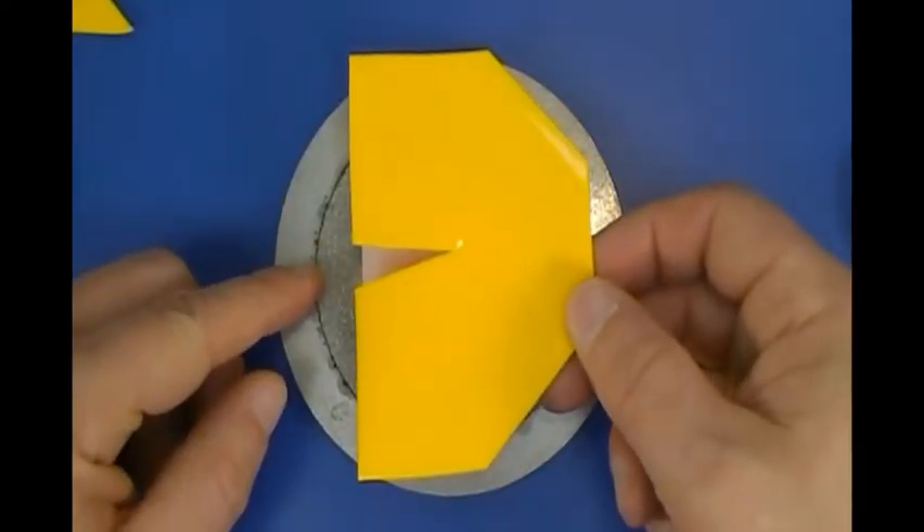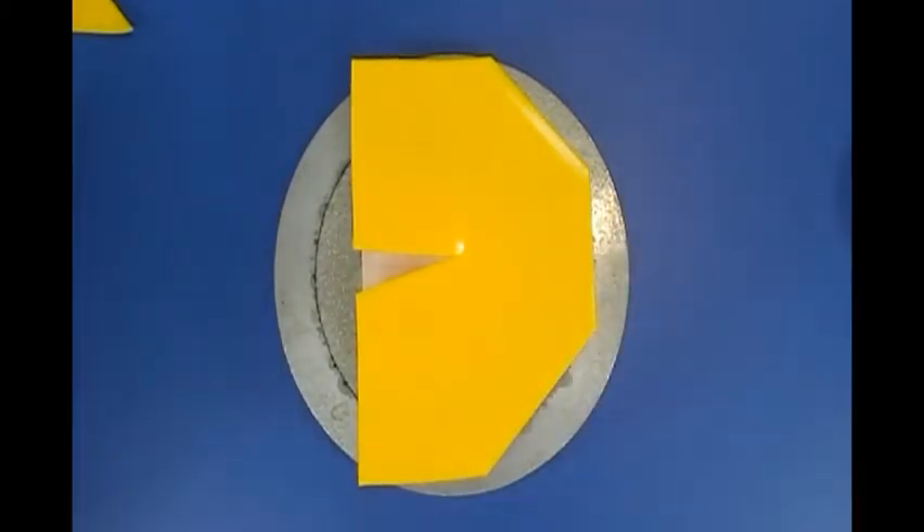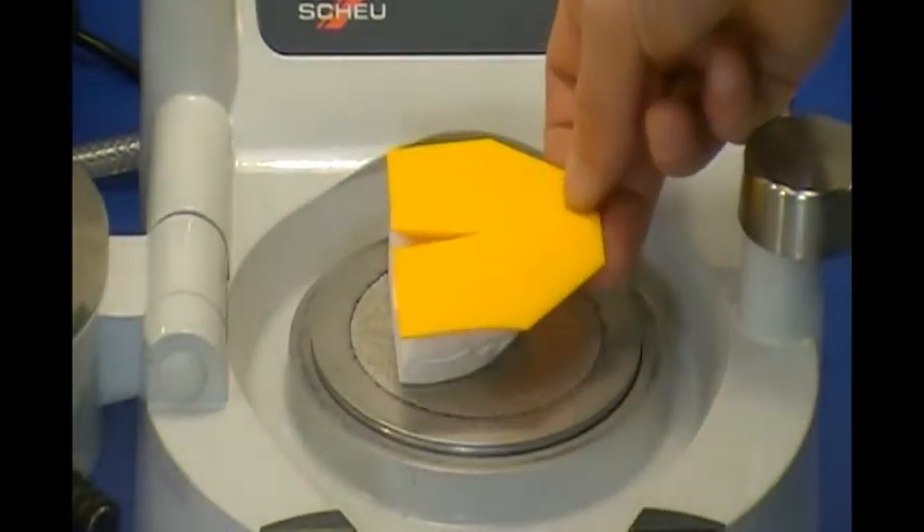With the model on the platform, check the size of the cut template. The long edge should be aligned with the heel of the model, and top and bottom cuts near the outer edge of the platform.